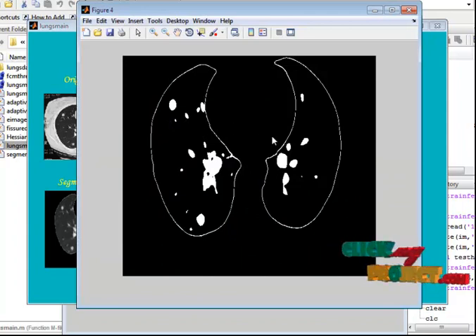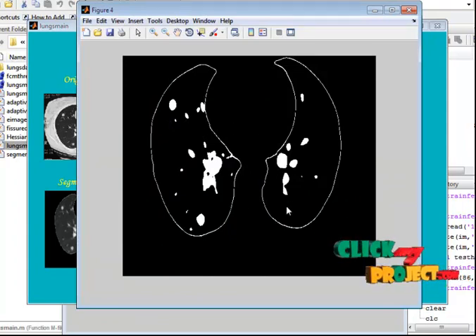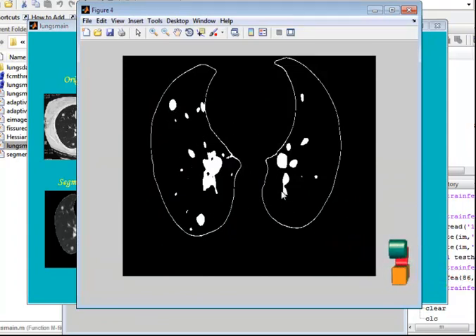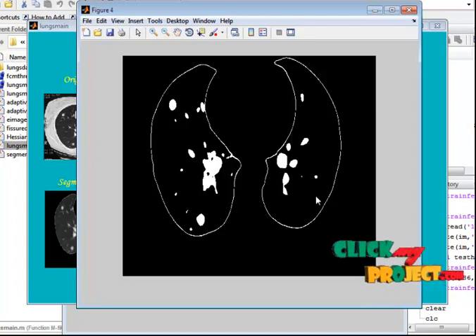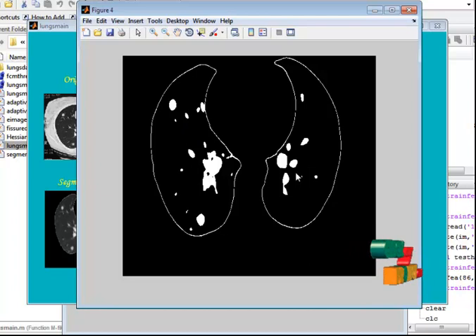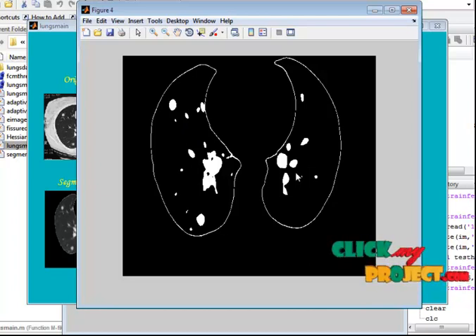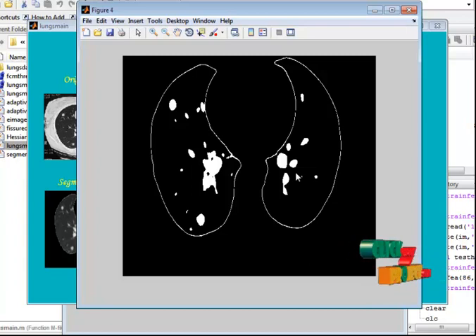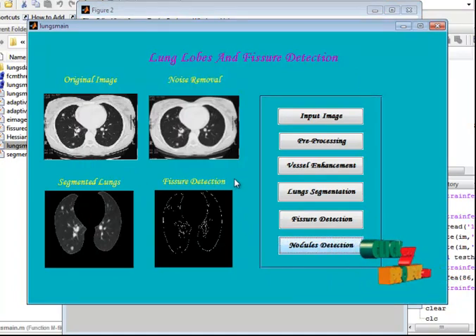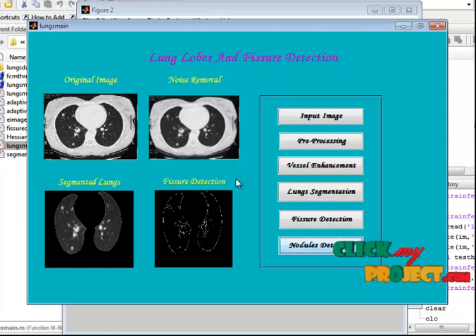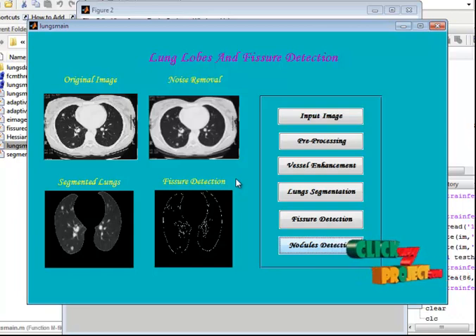This is the segmented result of nodules. These are the nodules present in the CT lung image, segmented from the CT image. For segmenting them, we are using adaptive thresholding. This demonstrates the method for lung lobe and fissure detection in CT images. Thank you.